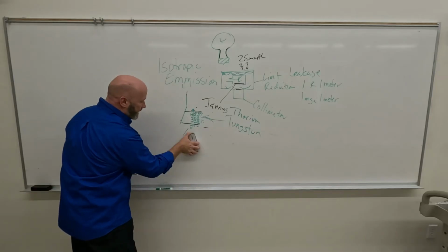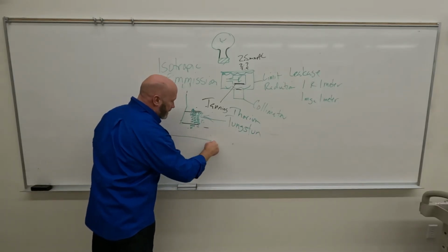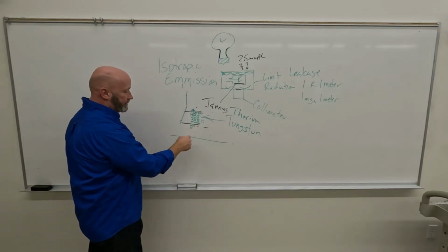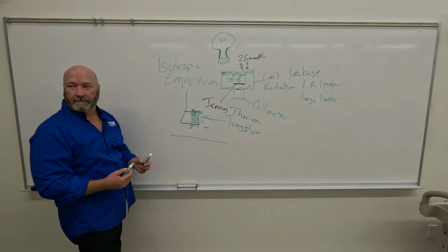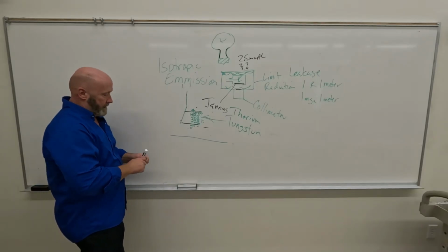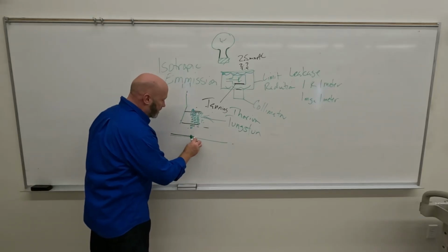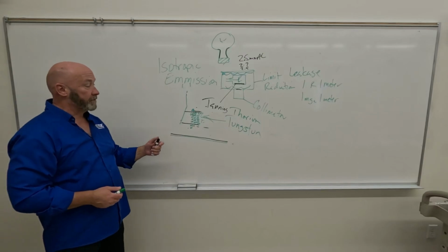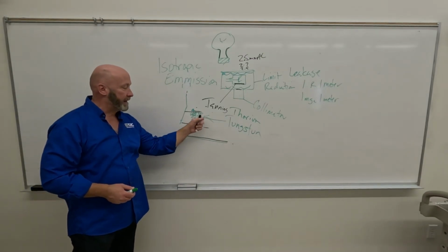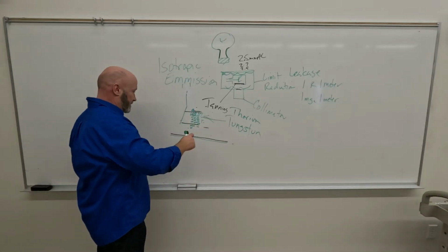Okay, where we had glass before, our electrons, which are all negative, completely ignored the glass because it was an insulator, right? And now we laid down a layer of conduction on it. What might happen to our stream of electrons, or some of the electrons, instead of going from cathode to anode, they may go from cathode to the tube.